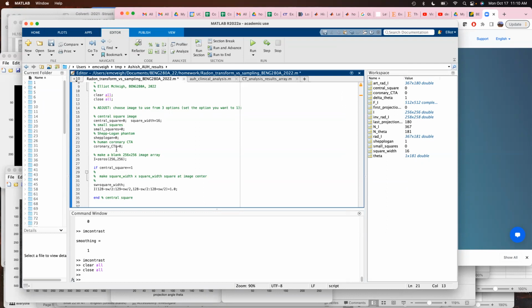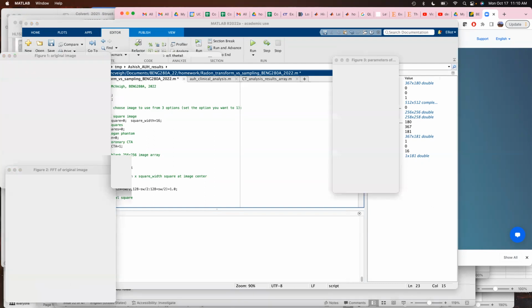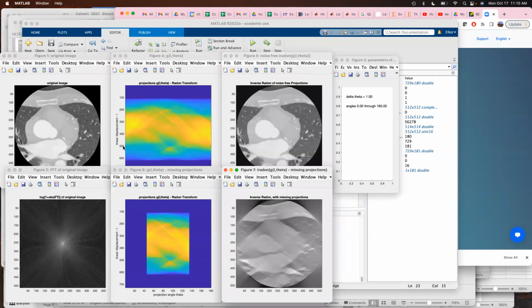And then we can look at our clinical. I hope I've got the data in there. Looks like I do. Okay. So this is a coronary angiogram, one slice of a CT. This is the left atrium, the aorta. These little dots here are the coronary vessels running through this plane, right? And they're the things that you need to resolve usually very accurately to determine if a person has disease.